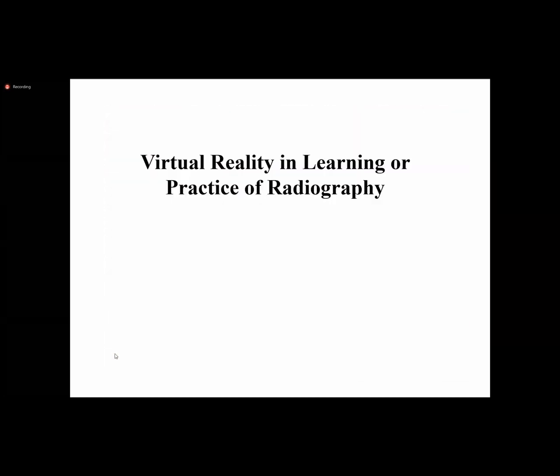So I think this was the best example of virtual reality, where the CT volume rendering images of the patient were fed into virtual reality and created a room where the virtual reality glasses can help us look at the anatomy in detail. We also have features in virtual reality to change the multiplanar view, like we can convert into coronal, sagittal, and axial. We can cut the section, we can zoom in, zoom out, and we can know each and every detail of organs in virtual reality. We can feel it properly.